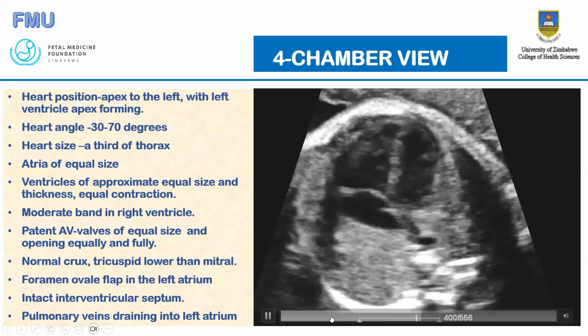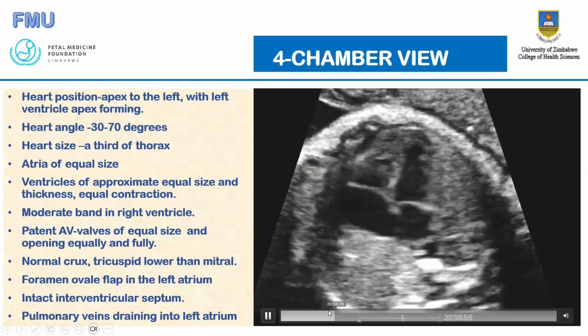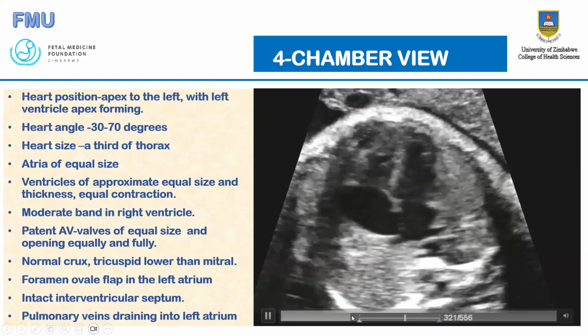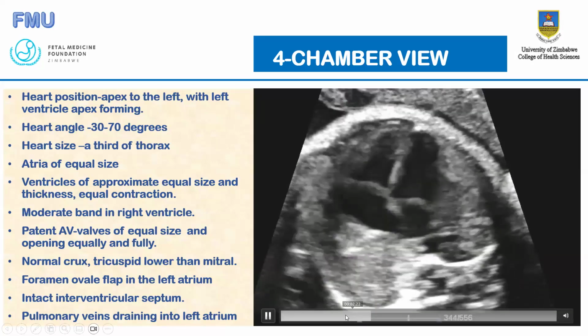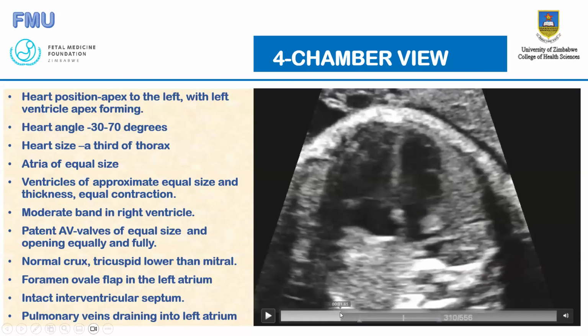We can slow down these movements and demonstrate the opening, unless our frame rate was low. Because if your frame rate is low, you are not able to capture the opening and the closing of the valves. You have to have a high frame rate. So we can see here, you can see valves opening. It's more marked on the left ventricle, the mitral valve opening, and then the valves closing.